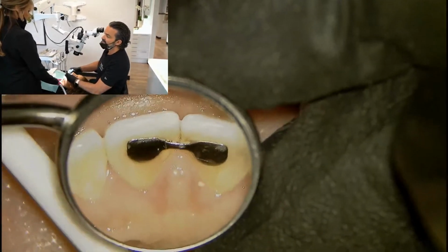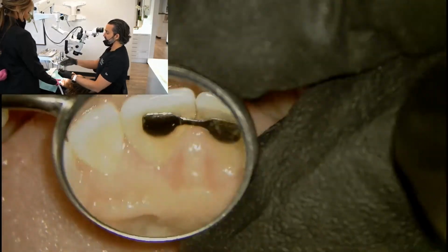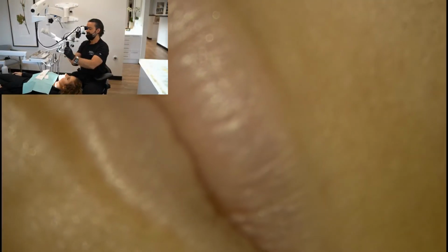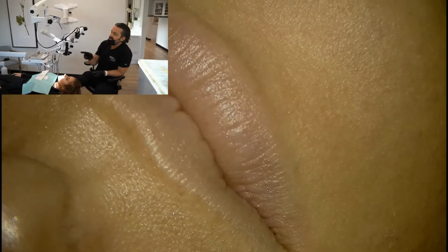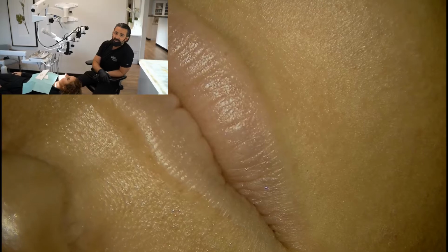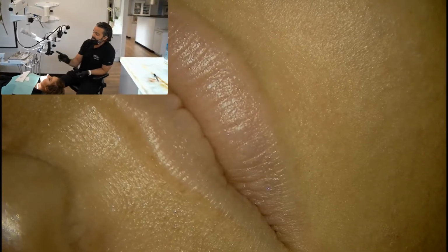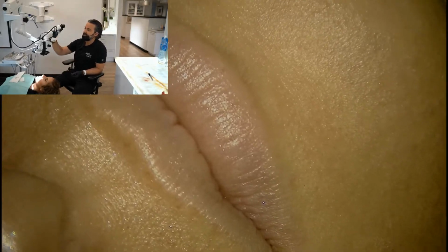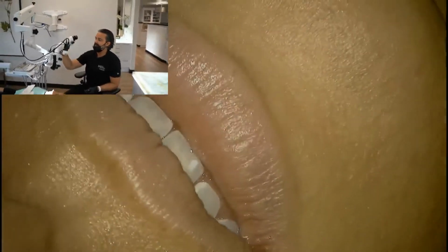And so it gets very comfortable. But I will always work in 12 o'clock because I will have access to the entire mouth like that. And again, the vast majority of people are probably over here, and that's fine if that's what you like. And then when you do that, you want to just sort of identify the features of a microscope that still gives you correct posture. So variable focus here, and then angle corrections up here, especially with this eyepiece.